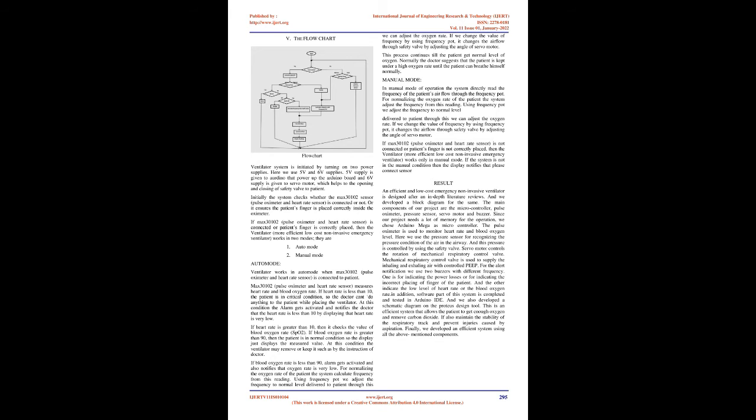The ventilator also causes an increase in alveolar capillary permeability and causes the activation of inflammatory cells and the release of cytokines. The consequence of this is that the alveoli are opening and collapsing much more than they would normally, and will also be subject to higher pressures in order to reopen them with each breath. This combination will damage the alveoli further. Positive end expiratory pressure, PEEP, is a pressure applied by the ventilator at the end of each breath to ensure that the alveoli are not so prone to collapse. This recruits the closed alveoli in the sick lung and improves oxygenation.